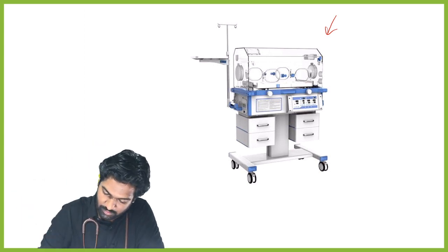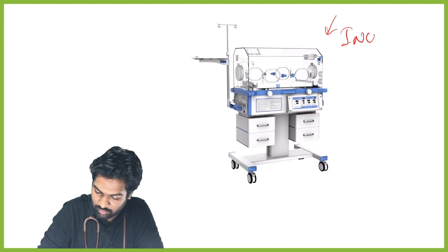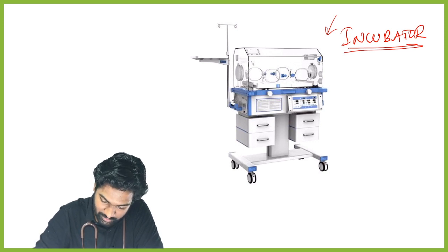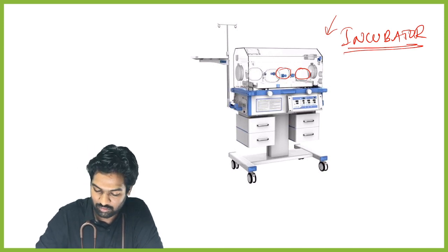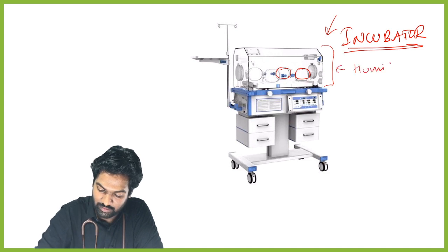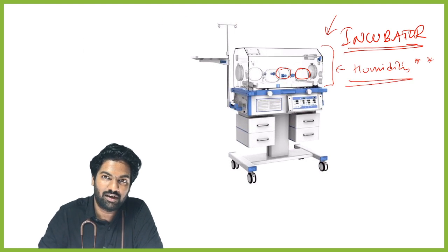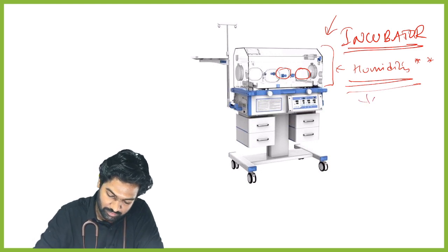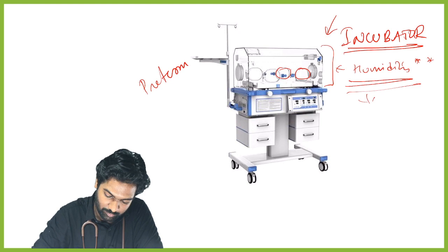Okay, fine. Now this is an incubator, as most of you have identified correctly. You can see apertures here. Through these you will be handling the baby, or if you want to do some procedure you can do it around this. The reason it is kept closed is that it will maintain the humidity, and it will try to keep the environment as similar as possible to the mother's womb. You know that this will be used exclusively for preterm, low birth weight babies.